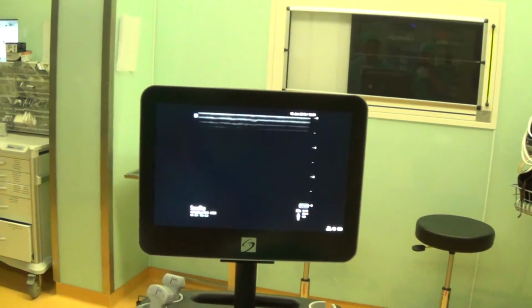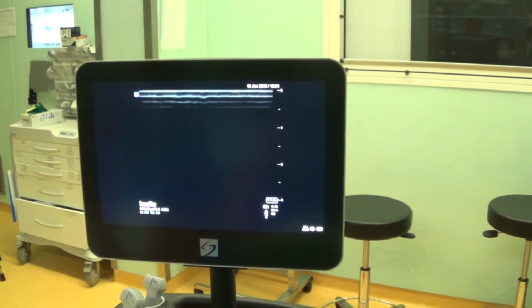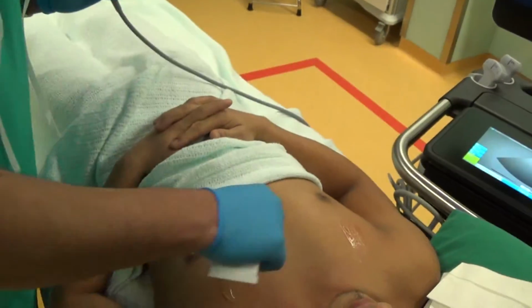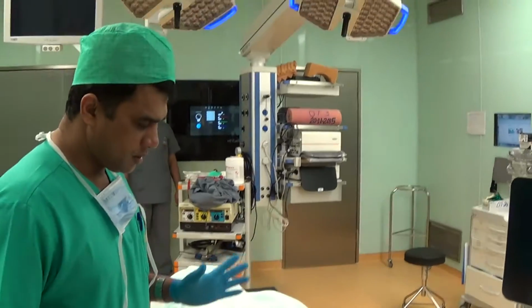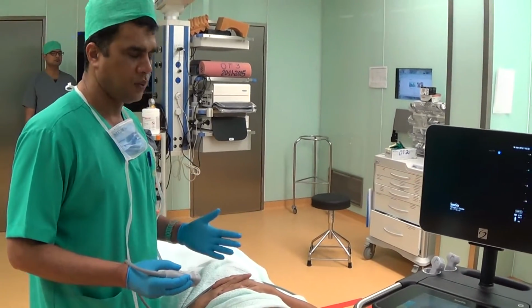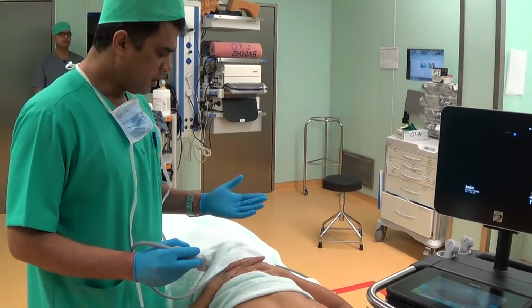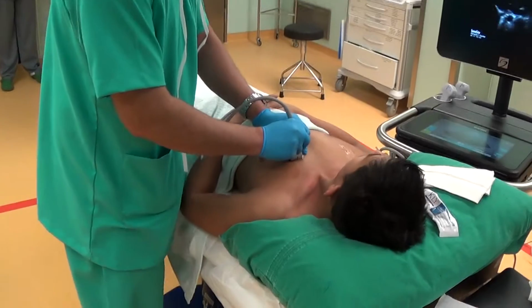As you know, we will go really deep into the cardiac examination. Anesthesiologists are more and more getting involved with cardiac echo to know their own patients' heart conditions prior to surgery. This is the best thing an anesthesiologist can learn. In due course of time, we will know the left heart and right heart functions separately, volume status, regional wall motion abnormality, diastolic dysfunction or HFpEF, heart failure with preserved ejection fraction. All those details will come in due course of time.